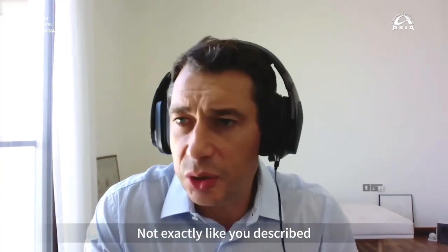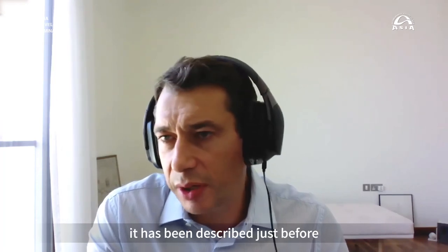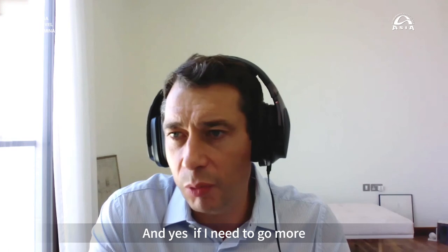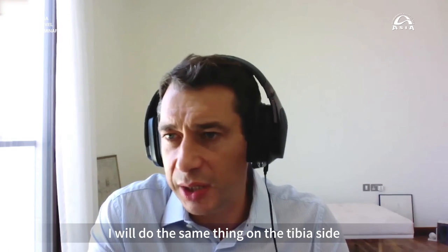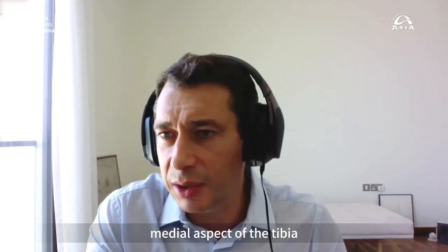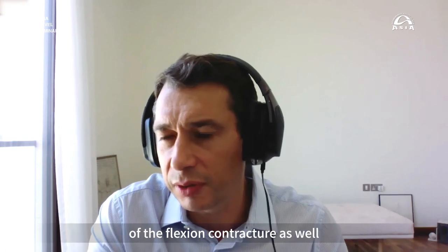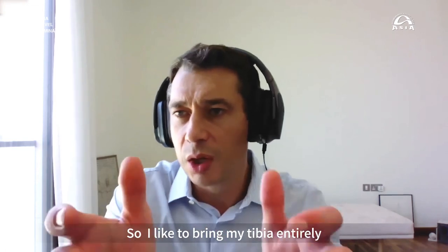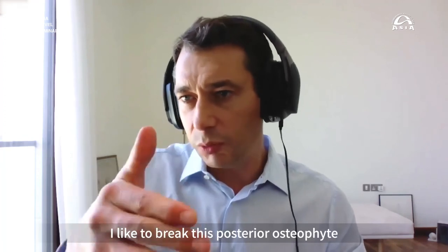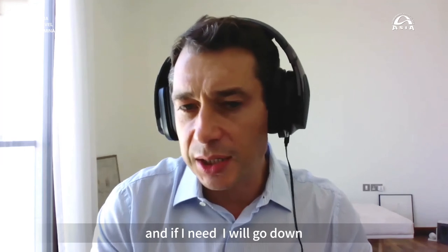Not exactly like you described. I'm staying exactly like it has been described just before, very close to the bone, and I like to start on the femoral side. And yes, if I need to go more, I will do the same thing on the tibial side. And there's very often some osteophyte at the posterior medial aspect of the tibia that we don't often remove, but it's helping a lot for the reduction of the flexion contracture as well. So I like to bring my tibia anteriorly. I like to break this posterior osteophyte. And if I need, I will go down.